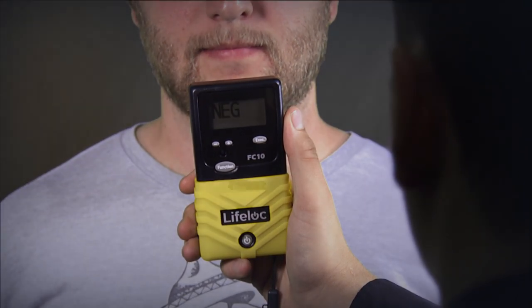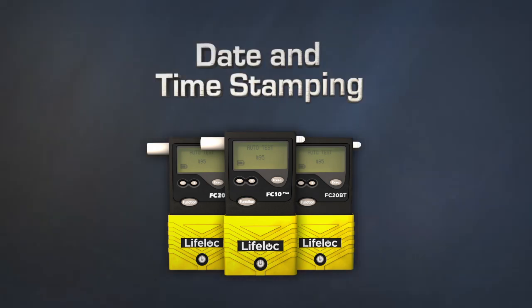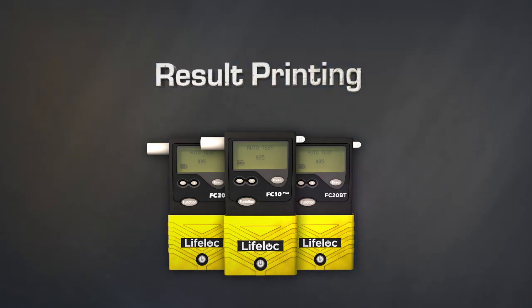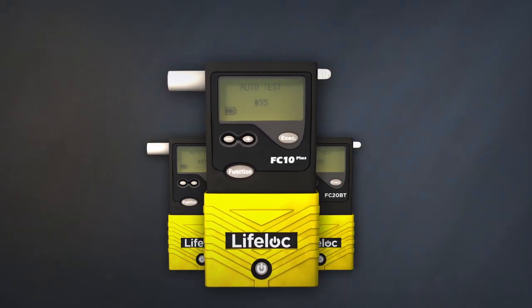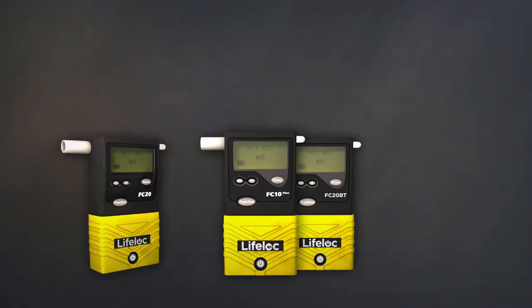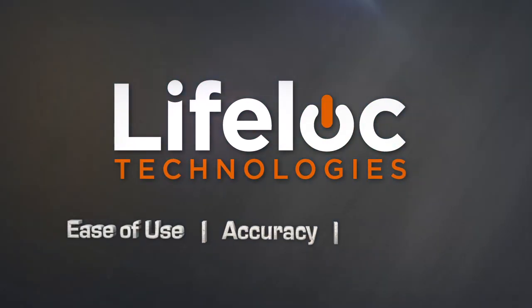Nothing could be easier or faster. For advanced features such as test memory, date and time stamping, result printing, computer interface, or Bluetooth connectivity, check out the FC 10 Plus and FC 20. There's no better choice for ease of use, accuracy, and reliability in professional breath alcohol testing than Lifelock.